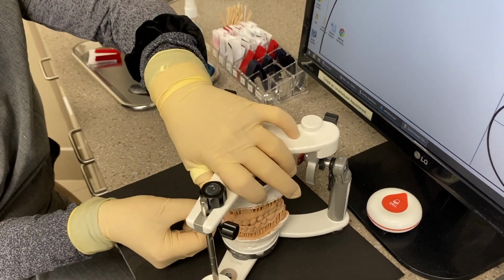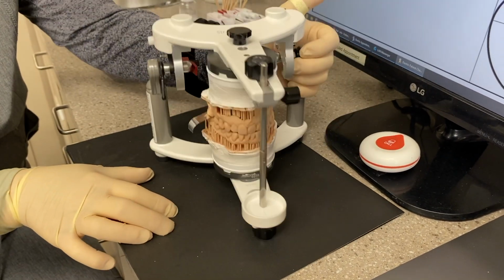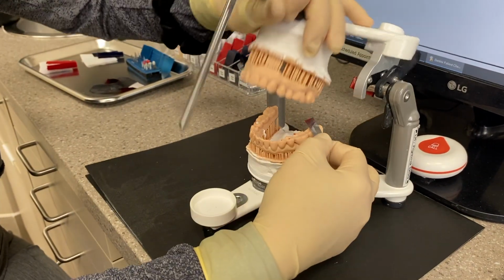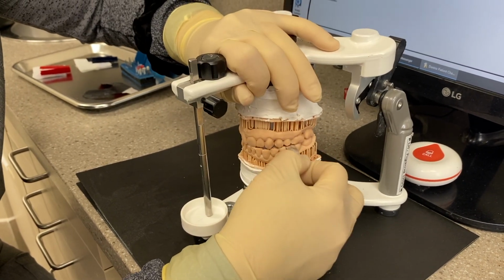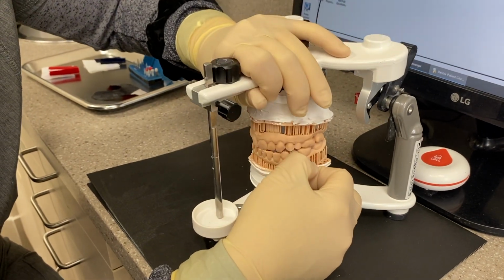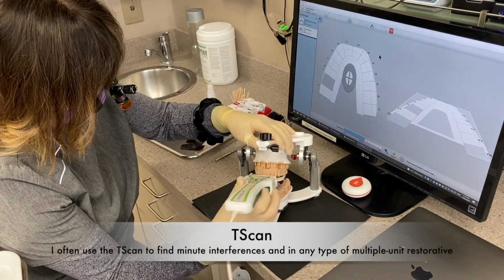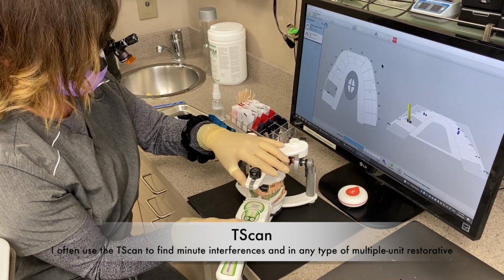Okay, so we're going to test these contacts again. This one now is marking quite heavily on the second molar, and let's see what's happening on this side. And there's an interference here on the 5. So both of these, just going to take a look. So it positions on the centrals. Oh, helps to record.